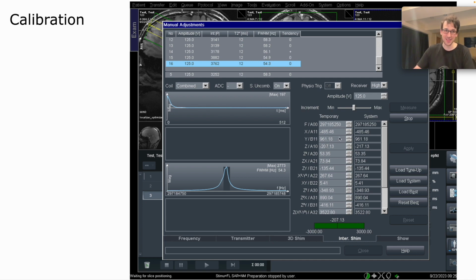And this is quite consistent. No matter which kind of protocol, if you increase this by 10, the full width half maximum is lower. It does not mean that the side lobes are also better. And it usually is not a huge game changer. But very often people change this, going 10 up, then wiggling around X, wiggling around Y, going back to Z, maybe in 2 iterations, and then leaving that, not touching the higher order terms here.